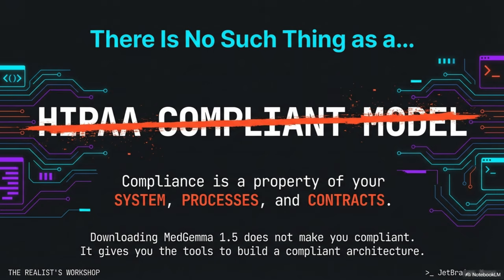But the fine print is crucial. Where do the numbers not save you? Well, the model still has specific weaknesses. Some complex visual Q&A styles can be harder to answer accurately, and overall report generation isn't automatically a solved problem just because other metrics improved. So the core takeaway is? It's an incredibly strong base model, but you should absolutely plan on adaptation and maybe even fine-tuning to perfectly fit your niche clinical use case.